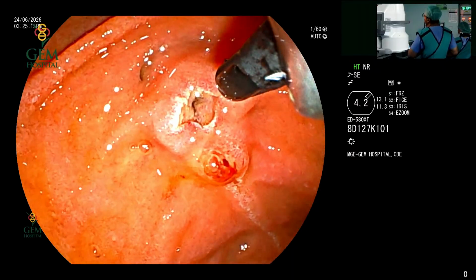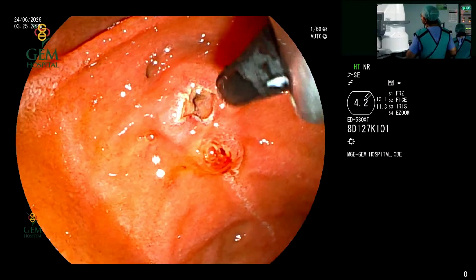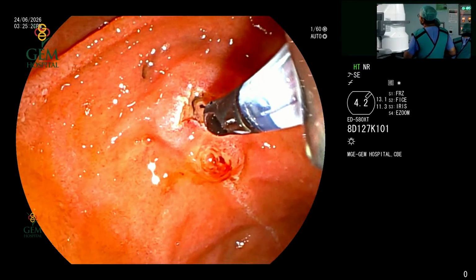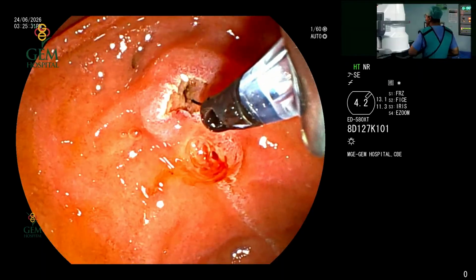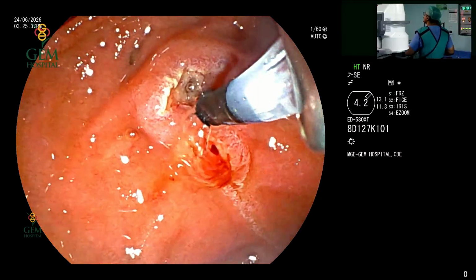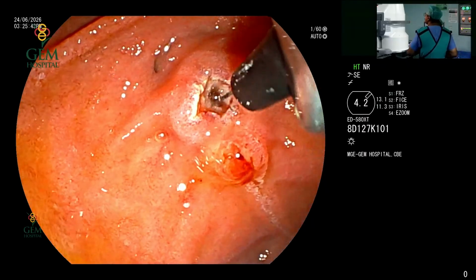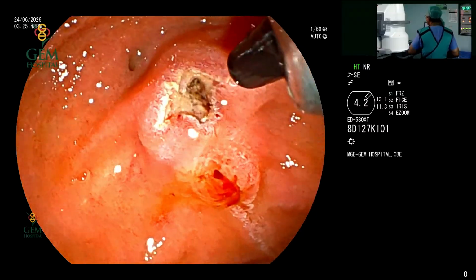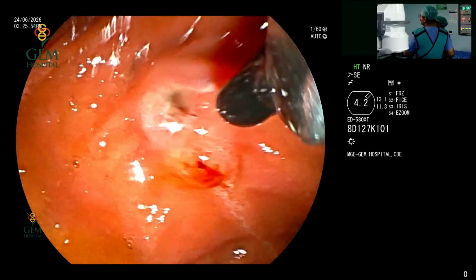The point of doing an access sphincterotomy is that it is layer by layer and much more defined than a crude cut from below. Needle out. You can see a little bit of a bulge which is appearing and disappearing. Since this could be a passed stone, we are dealing literally with a normal duct. The monopolar device which we are using is an RB cautery device attached to the needle knife. Wash. The setting is Endocut 1 with 60 watts and effect 2.